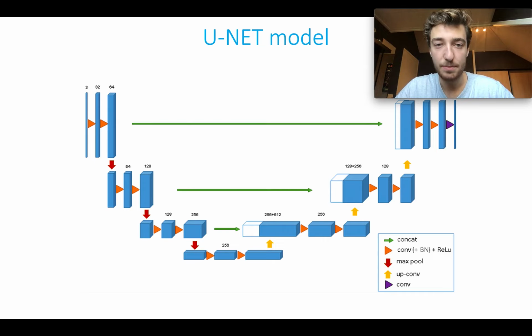And this is the main point the UNet model does. Because after this concatenation, it is going to do this concatenation with each layer while reducing the amount of feature maps with the convolution layers, and also building up dimensionality again with the upsampling layers.